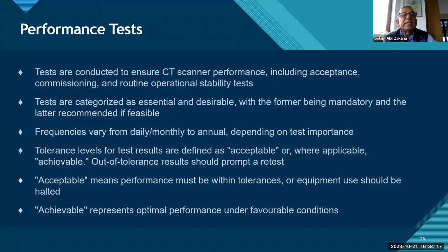Tests are conducted to ensure the CT scanner performance, including acceptance, commissioning, and routine operational stability tests. Tests are categorized as essential and desirable, with the former being mandatory, that means essential is mandatory, and the latter, that means desirable, is recommended if feasible.